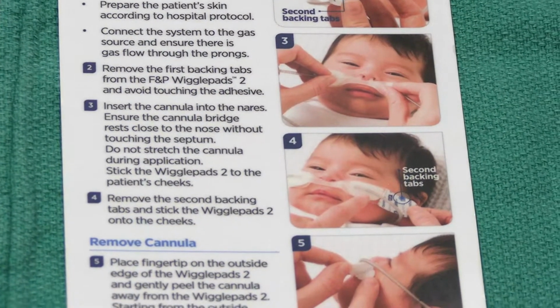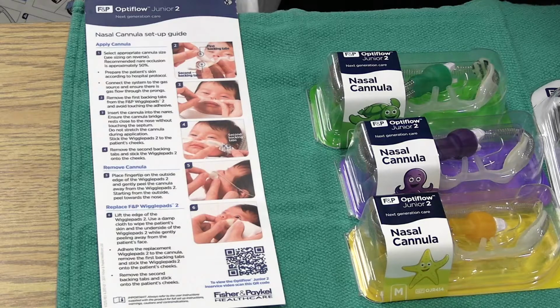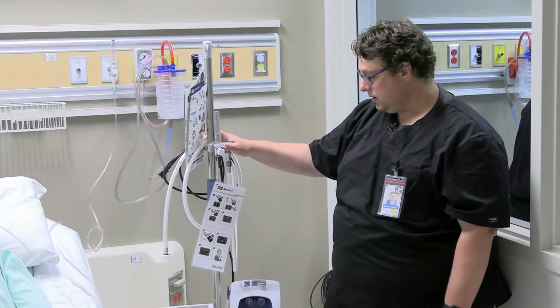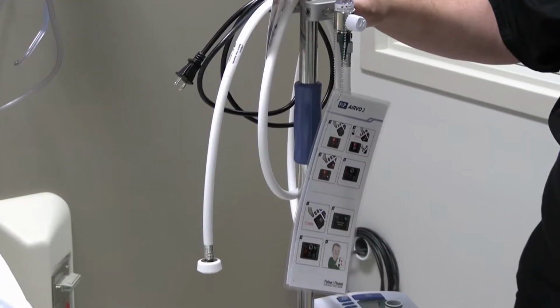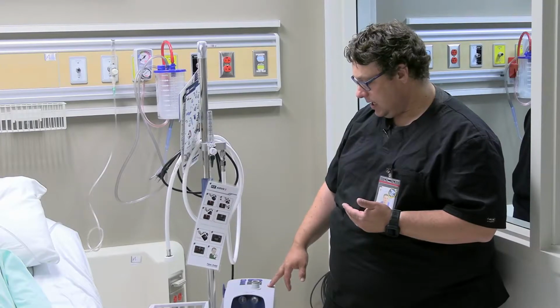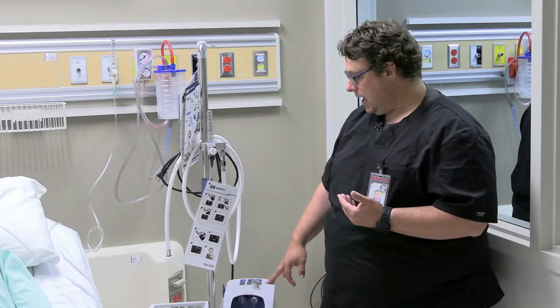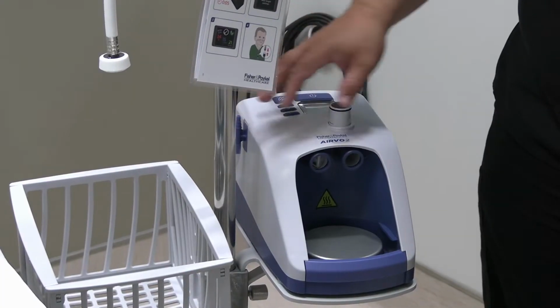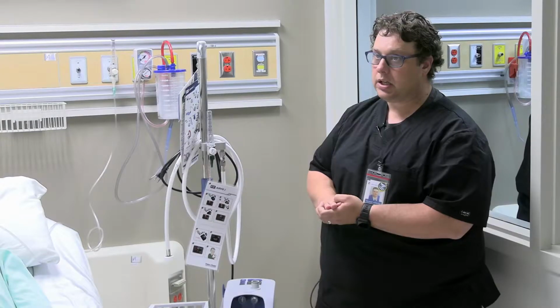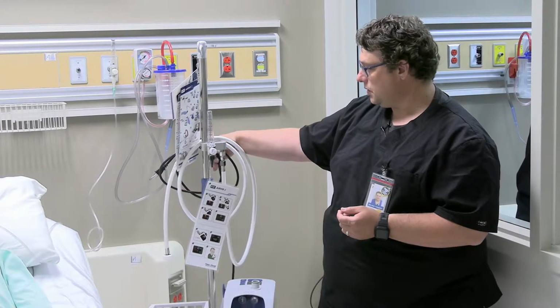And all that does is it takes you through the steps of prepping the prongs for patient application. So here we have our AIRVO device that we brought to the bedside. And as you can see right now, it's not set up for patient application. It basically is a machine that generates flow at high levels. We tee in oxygen therapy through there, as well as we have a humidifier pot that will humidify and condition the gas. So first things first, we'll go through our connection.